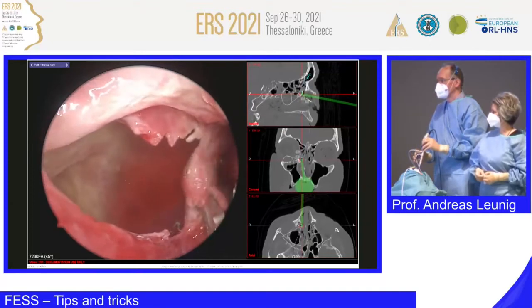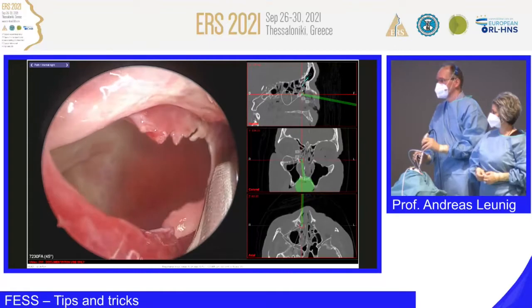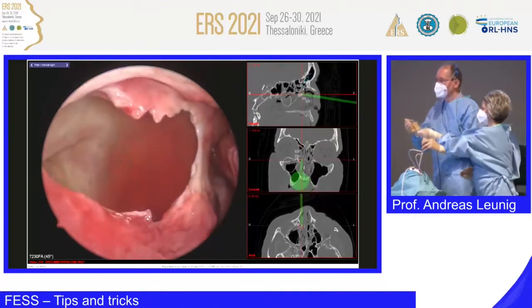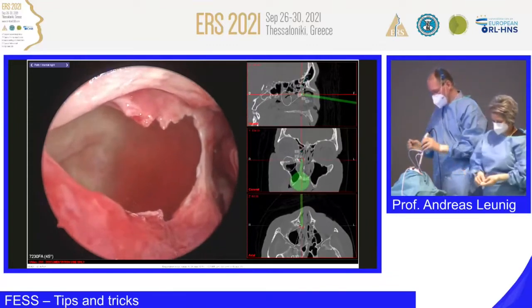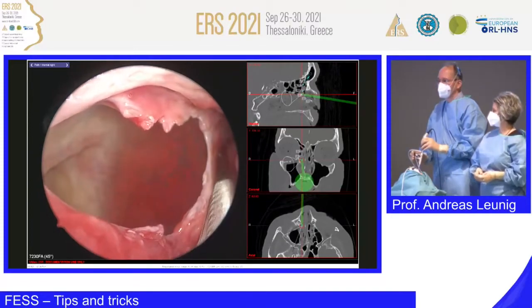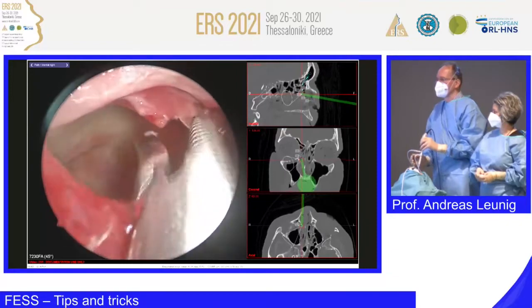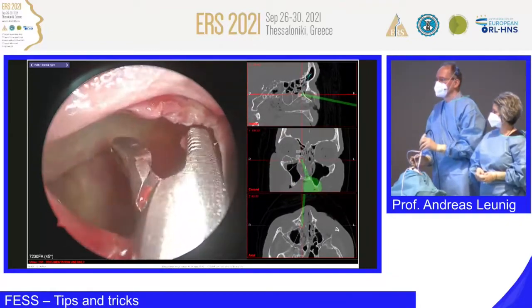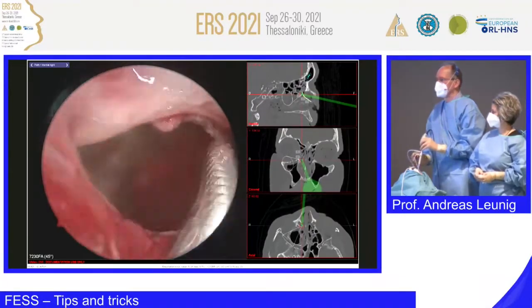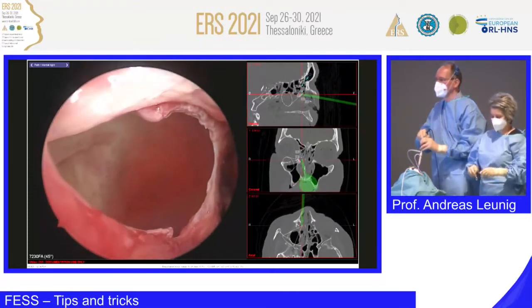So sometimes you can have a bleeder here, a spurting vessel. These are branches from the sphenopalatine artery. So you should be aware when you enlarge the natural ostium of the maxillary sinus, not posteriorly, yes, there can be as well, but more inferiorly where you find the attachment of the inferior turbinate. So I wouldn't do more here, that's looking all good. We spare mucosa. I tell you why, because mucosa is our friend, that's a functional organ of the nose.